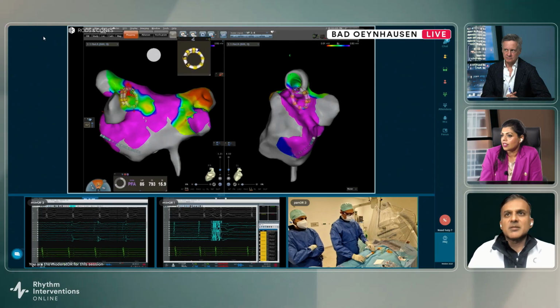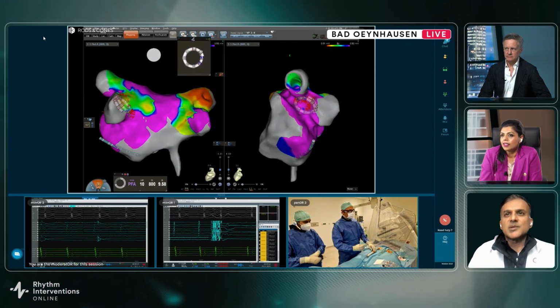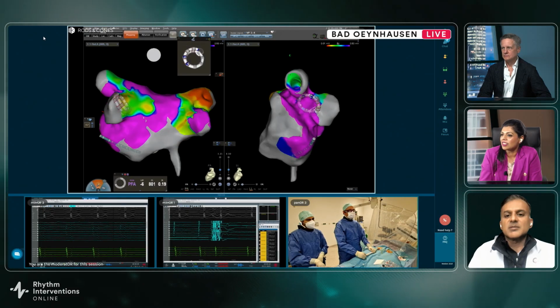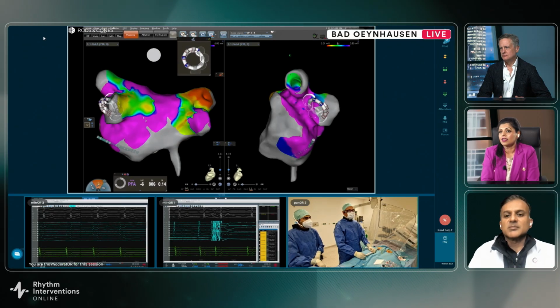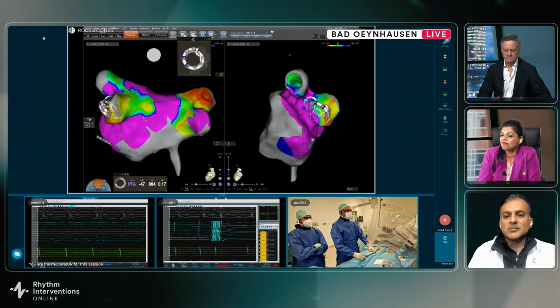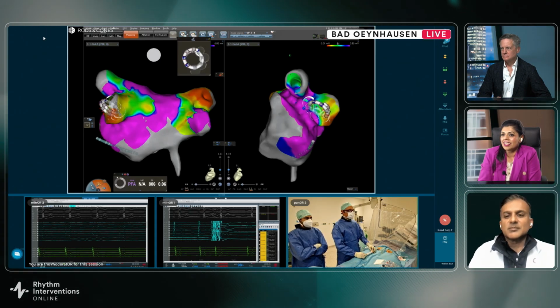So I think the catheter does well with that flow, and except for the fact that we have to go and turn it on every time, I don't think that's as big of a deal. I think it's going to become automated. I might be getting too ahead of the curve, but I think it is going to get automated.